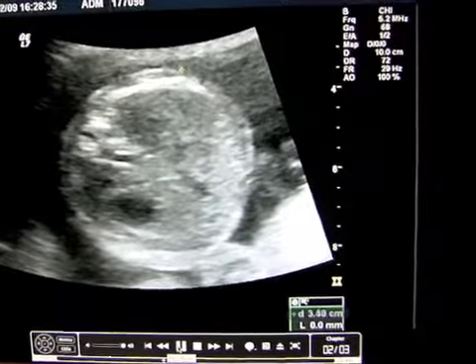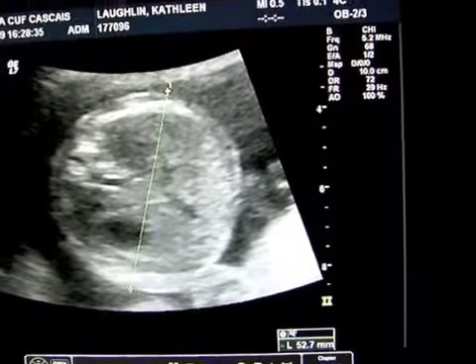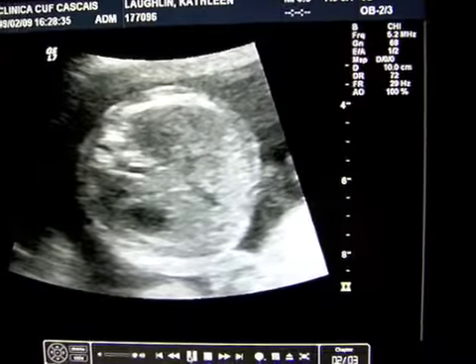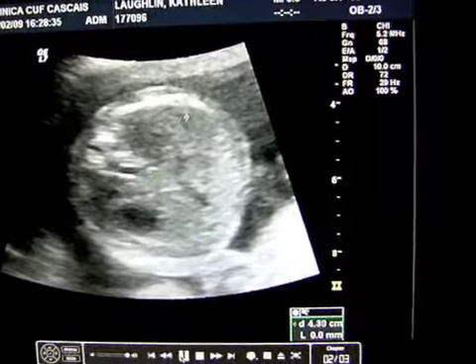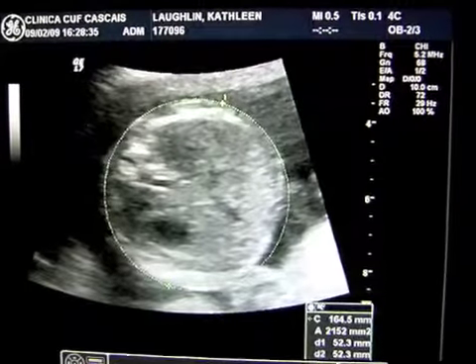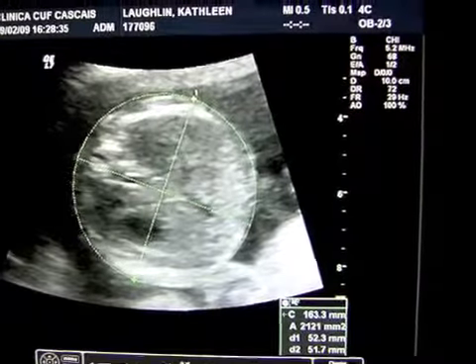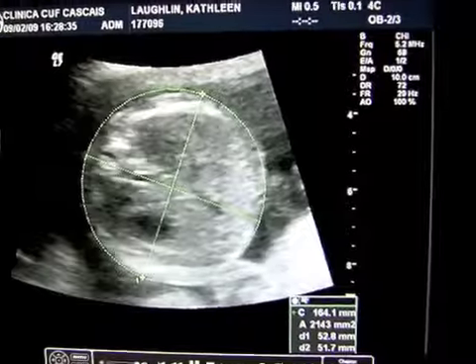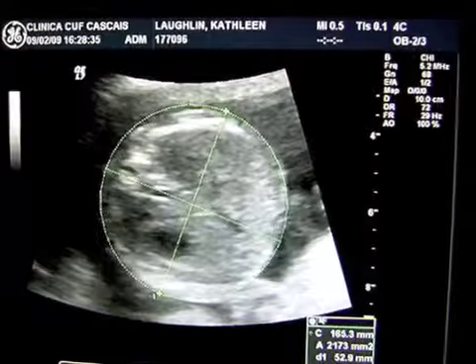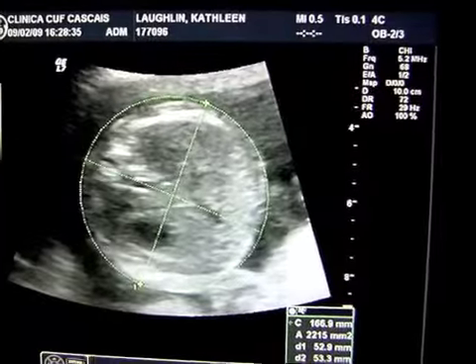Okay, at this point I actually asked if we were looking at her bum, and interestingly we're looking at her tummy. So it's a cross-section of the abdomen, and he was measuring her abdomen, and he actually thought she had kind of a little bit bigger tummy. He said most women don't like this measurement because they think it's some reflection on how much they're eating. And I guess in my case it was, because her tummy was a little big. A little on the big side, not super big, obviously, within the norm, but on the higher end of the range of size. So that's a little cross-section of her tummy. That was kind of cool.